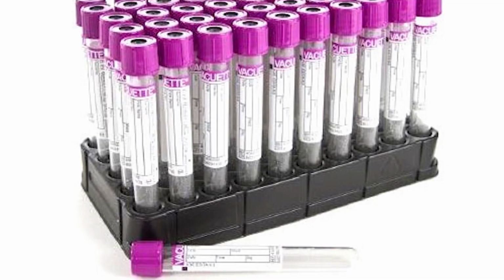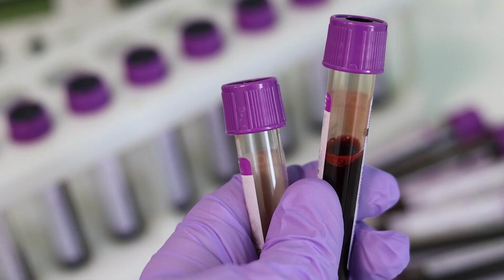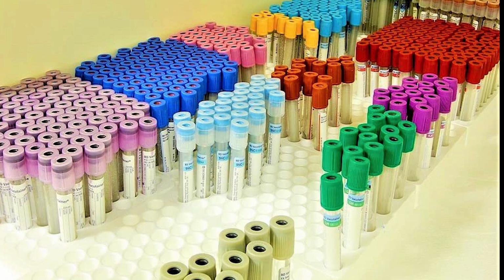Next is the lavender top tube containing potassium EDTA, commonly used for hematology tests and HbA1c in the chemistry lab. The next tube is the pink top tube, which contains EDTA, used for blood grouping and cross matching in the blood bank.